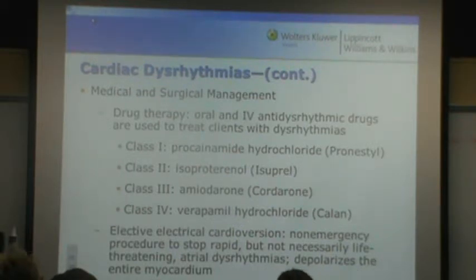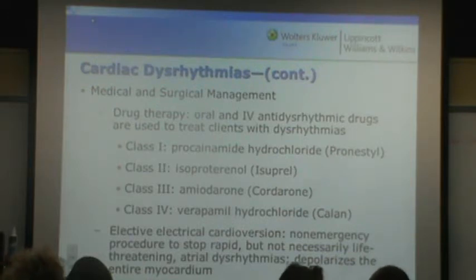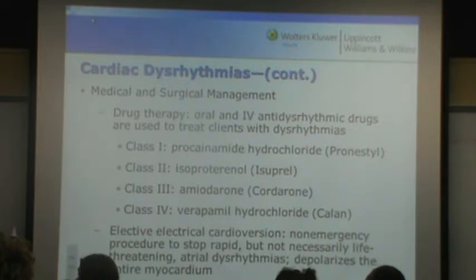You'll notice on the strip that I'm passing around now that it has all of the QRSs marked. It's in what we refer to as sync mode. If you look at the top of it, you'll see it has an S above every QRS.